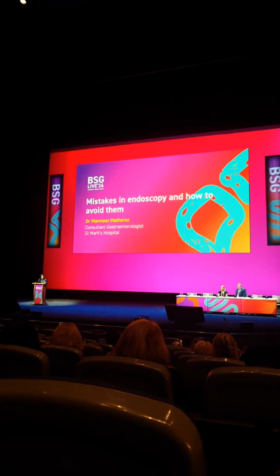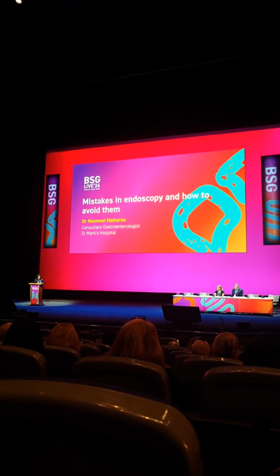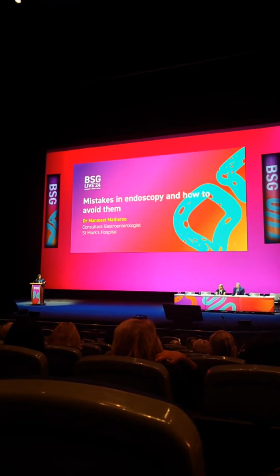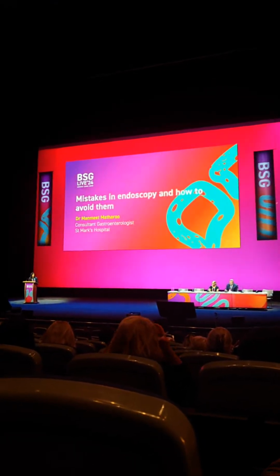However, you don't need to always do retroflexion, because if, for example, there's a scarred colon, or it may not be easy to do because you've got an Endocuff, then you could cause patient injury, perforation. So I think about why you're doing it and think about how it's going to help you. If it's going to, then go ahead. If it's not, then don't do it.